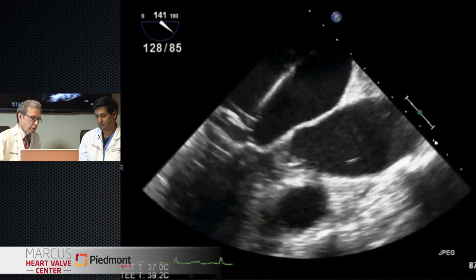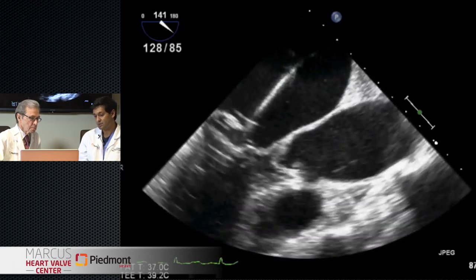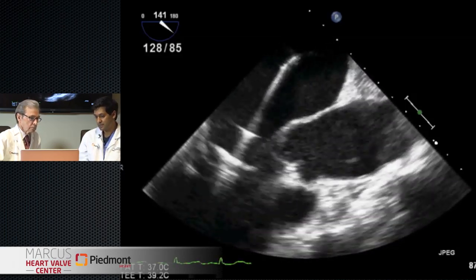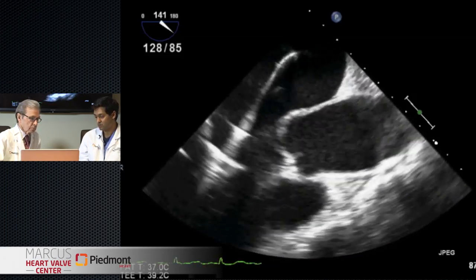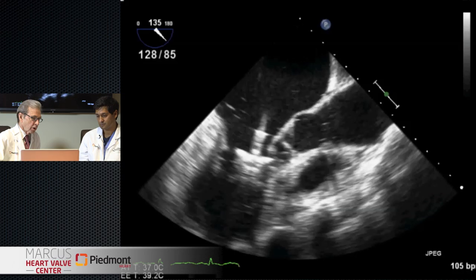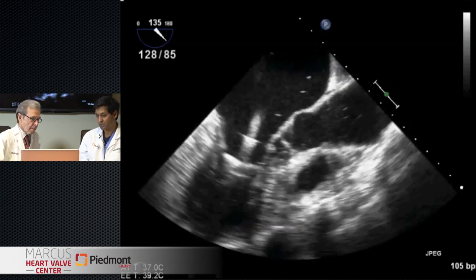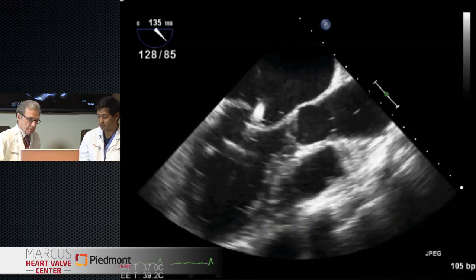You see the arms open. Once we're confident about arm angle, we want to enter the ventricle - using 2D echocardiography we can guide that. We want to see if the catheter shifts or spins as we go in, because that can be a sign that we should stop, retract, and reposition. It looks pretty good as it's entering the ventricle. Now we close the arms a little bit so that it's in a catching angle. Once we're happy with that, we're going to start slowly pulling the catheter up and see if those leaflets will lap into the arms of the clip.